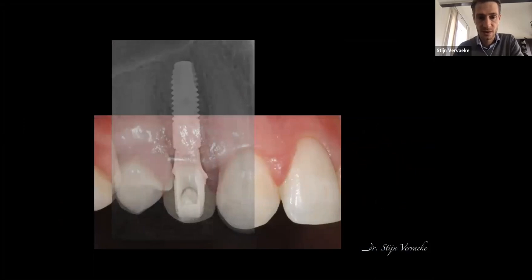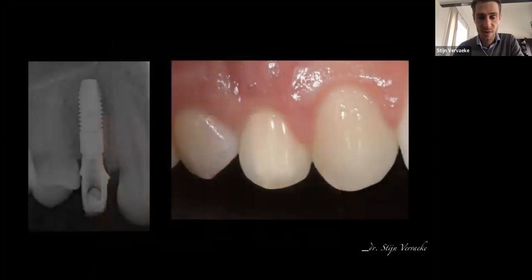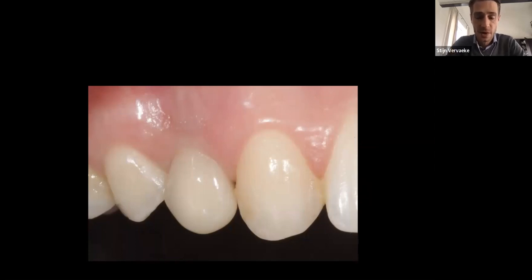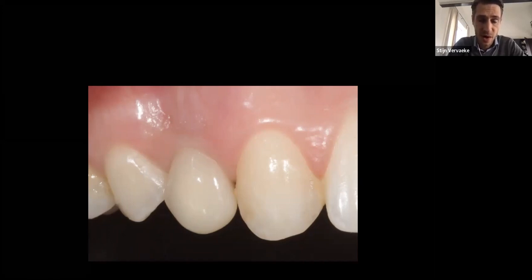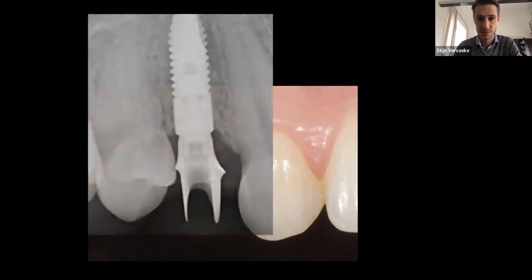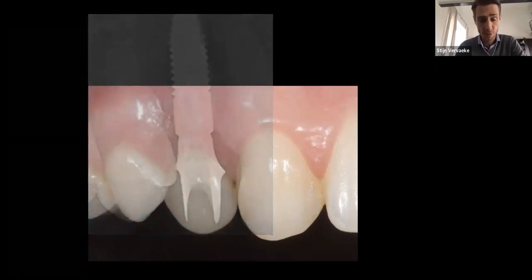So this is then the final abutment with the temporary crown, 3 months after implant installation. You see a very nice adaptation of the soft tissues. And then, of course, we have to transfer the situation to a final restoration. So the final crown that is made by the lab is sent to us, and then of course you have to remove the abutment once to be able to cement the final restoration on the Atlantis abutment outside the mouth to be able to control cement excess, and then of course you can immediately reinstall the final restoration in the patient, as you can see here with a perfect adaptation of the crestal bone, let's say here 6 months after implant installation.